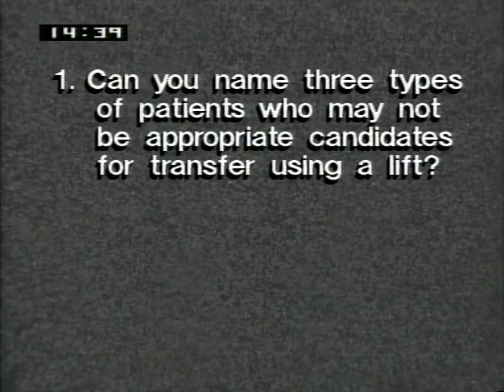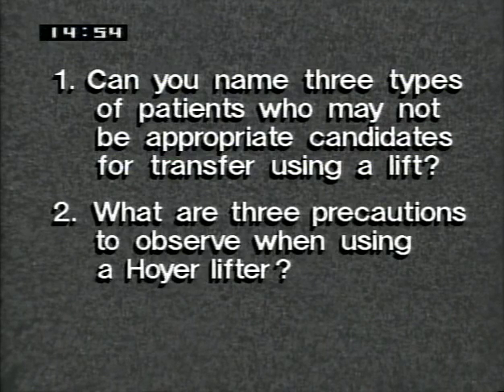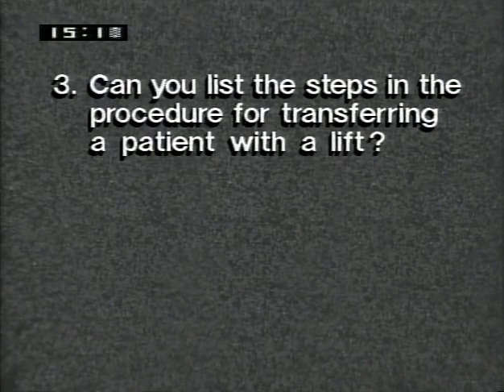Can you name 3 types of patients who may not be appropriate candidates for transfers using a lift? What are 3 precautions to observe when using the Hoyer lifter? Can you list the steps in the procedure for transferring a patient with the lift?